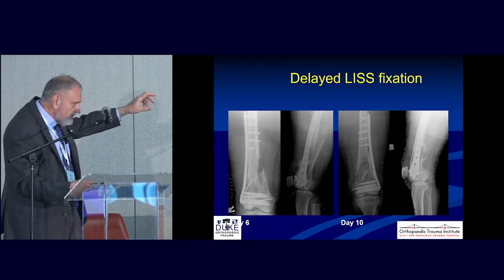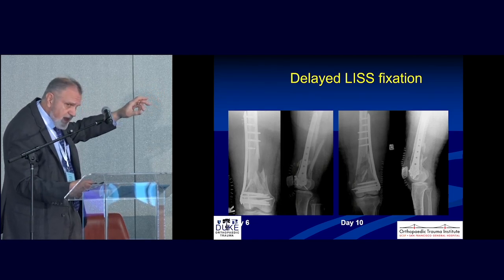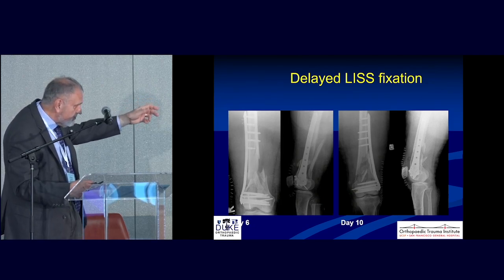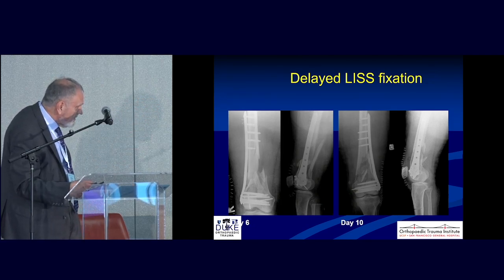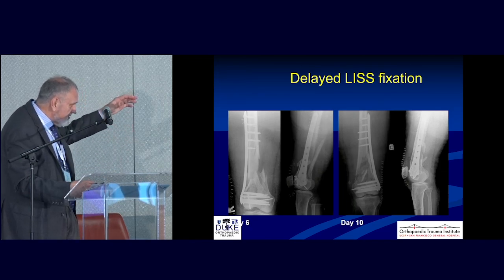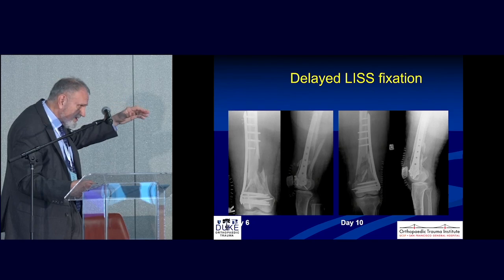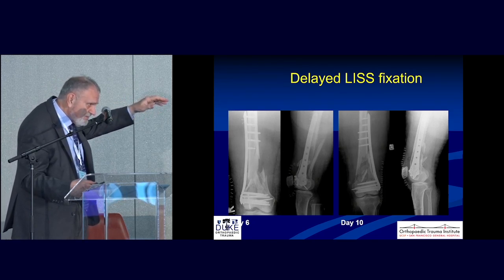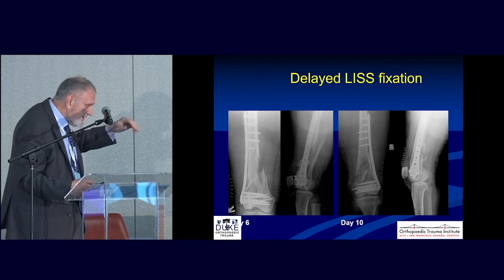So I don't have to worry. Imaging often is hard to get, with the guide managed up with the jig and everything else, but I find it easier just to directly put it on the femur so I know it's centered. And then take a little bit of time to make sure that the proximal end is on the femur, because sometimes you can get the 4th or 5th screw from the end on the femur and find out that the top of the plate's a little bit off, so you want to make sure you get that right.